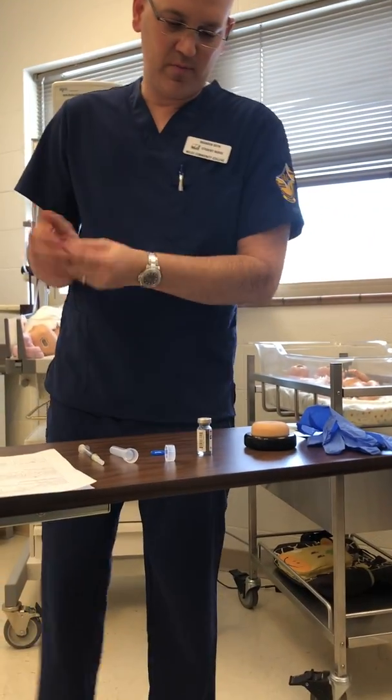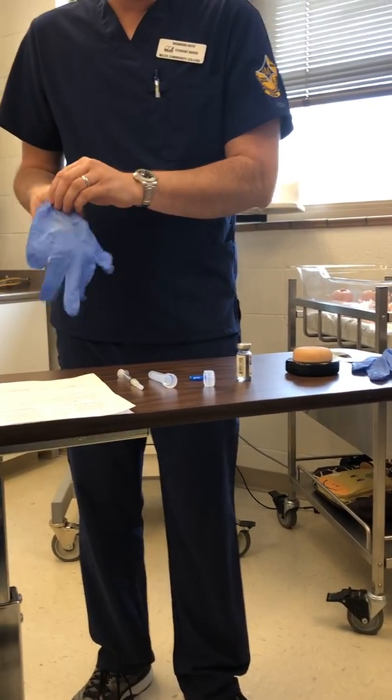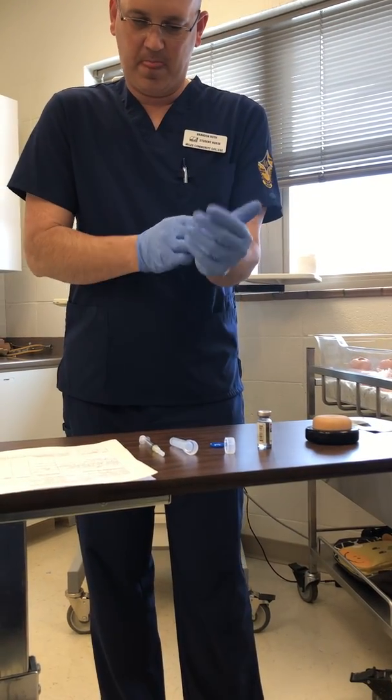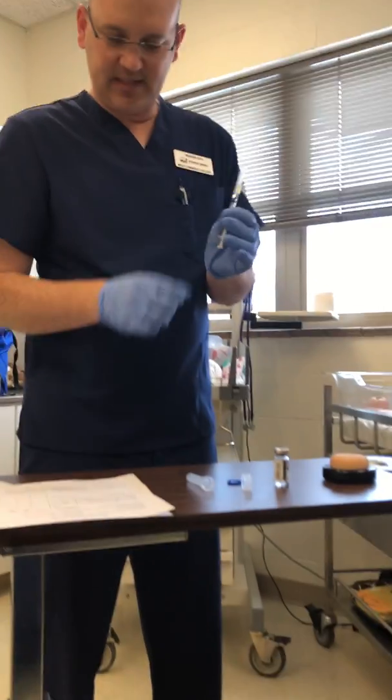I will now wash my hands, dry them, and put on new gloves. Again, I'm going to verify that it's 0.1.